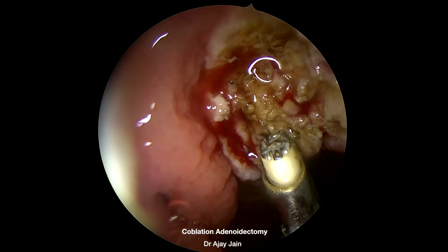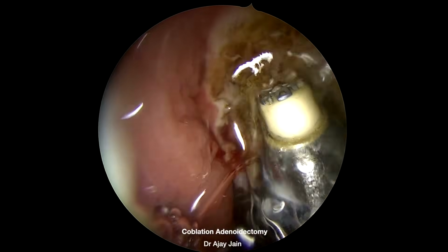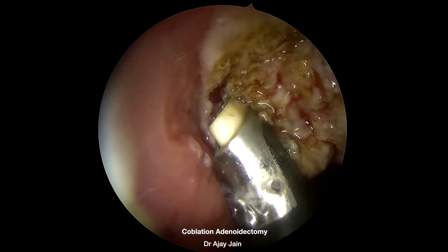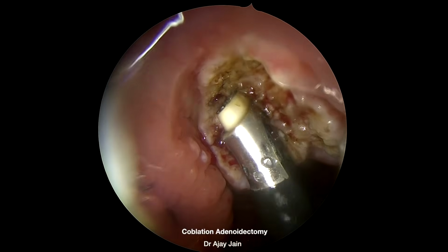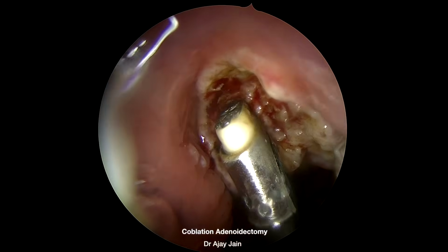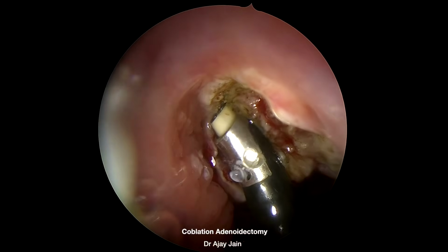As I said, intermittent nasal irrigation further improves visualization. And whenever bleeding occurs, first suction the blood, identify the exact bleeding point, and then apply the coagulation precisely. Blind cauterization should always be avoided. Always keep the posterior lip of the eustachian tube under vision to ensure complete yet safe removal of tissue.